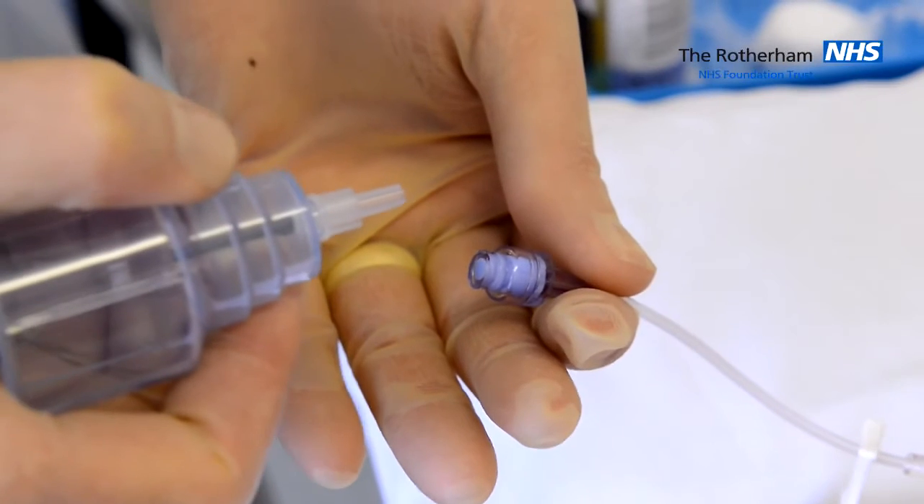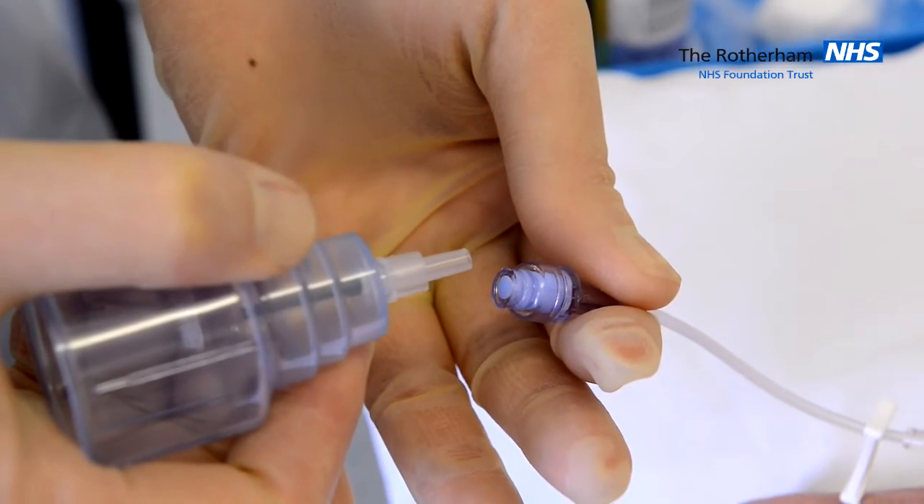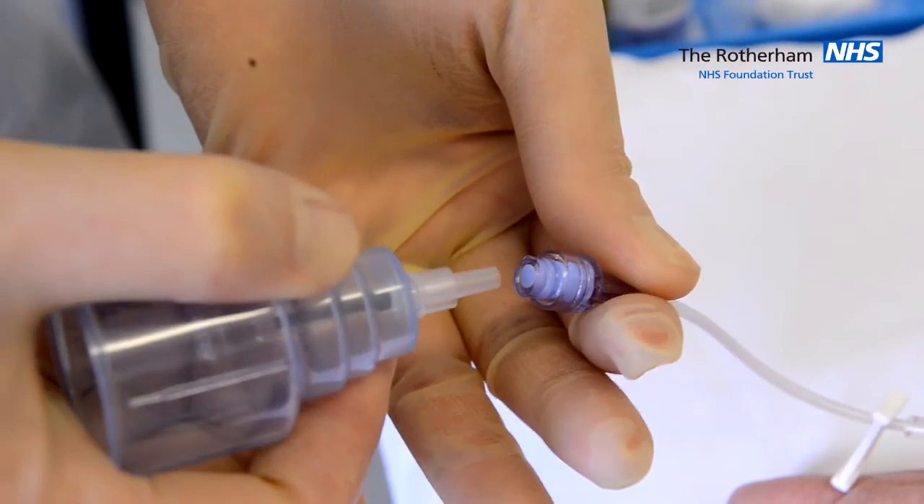Once you have cannulated your patient, secure the cannula and attach the extension. Do not contaminate the needle free device or the adapter.